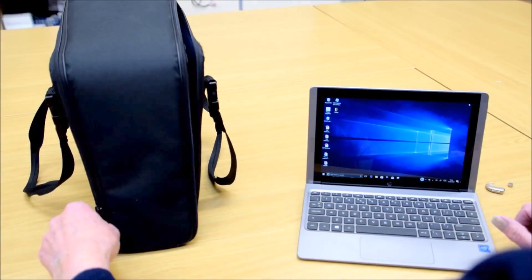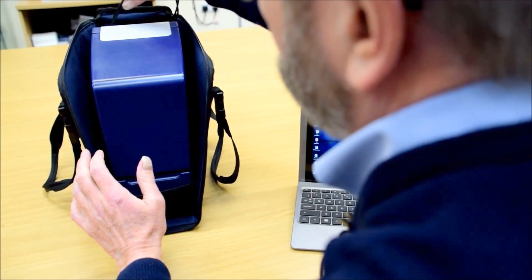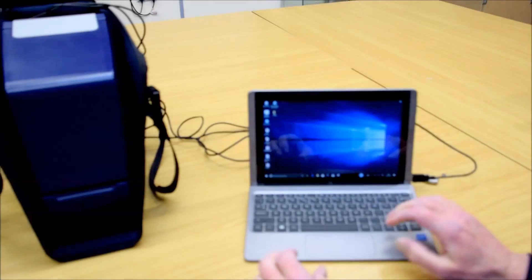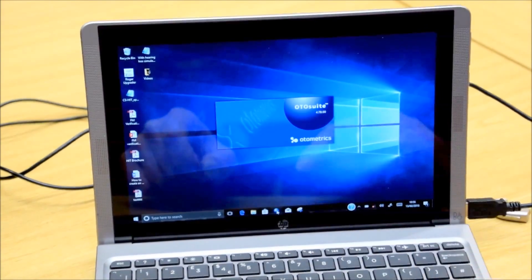Unzip the case. All the leads are stored behind the flap. Plug the USB lead into the port on the side of the tablet. You then click on the OTOsuite icon — a blue globe on the task bar.